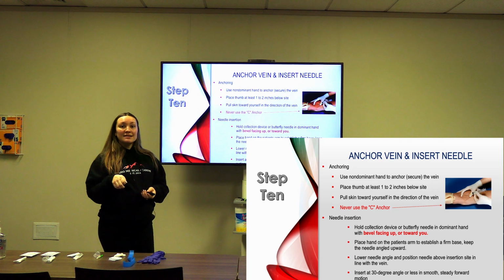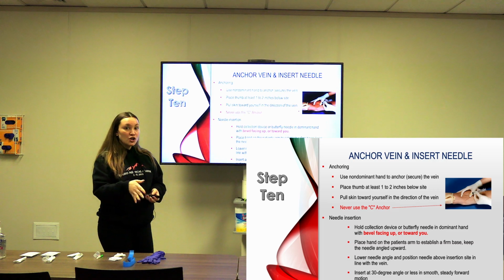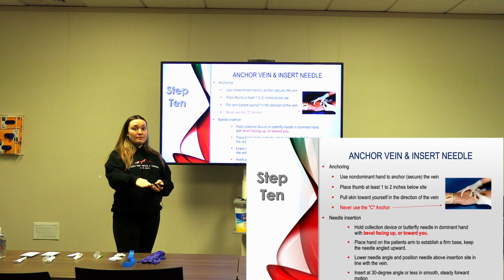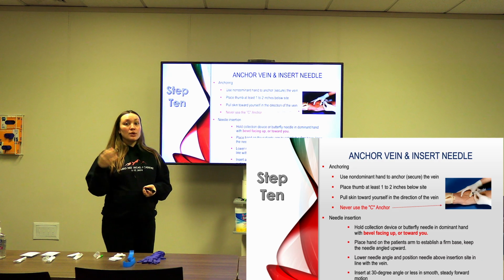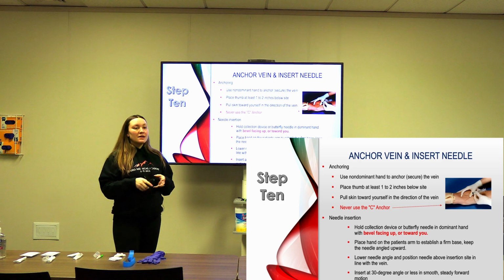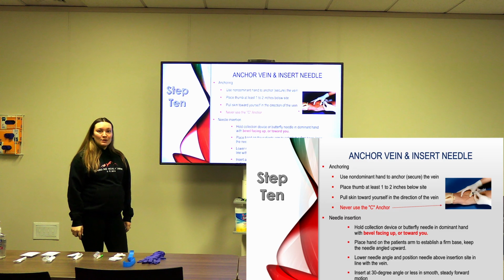We don't want hesitancy, okay? We don't want an accidental puncture and then a back out and then a puncture. We want one nice smooth motion, okay, puncture into the arm. That way, it's less stressful for you. It's less stressful for the patient. We don't contaminate the needle and repoke using the same needle. Okay, there are lots of components to this, which you'll get to practice and we'll work on.